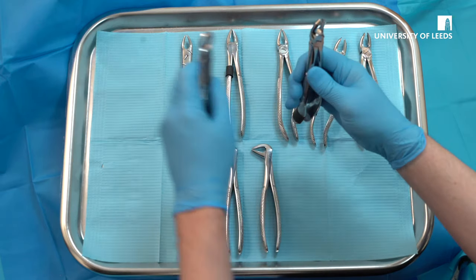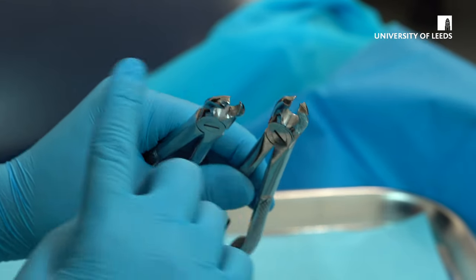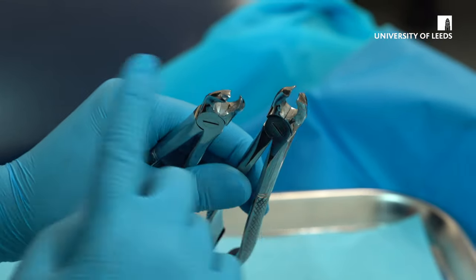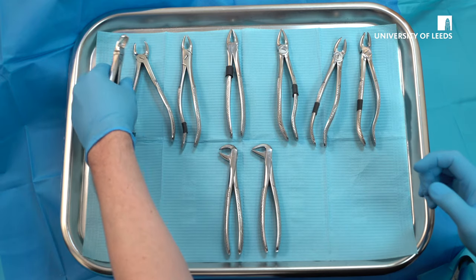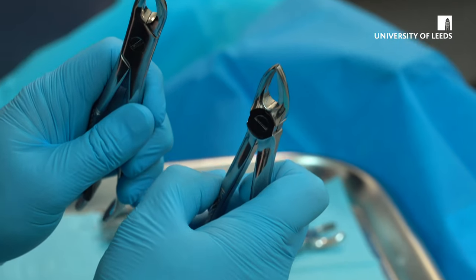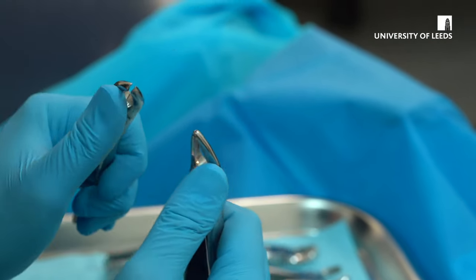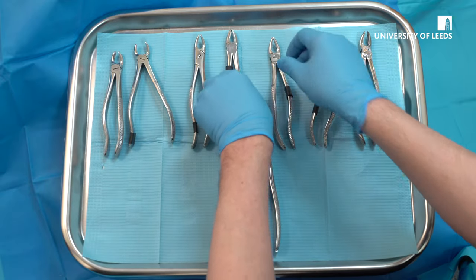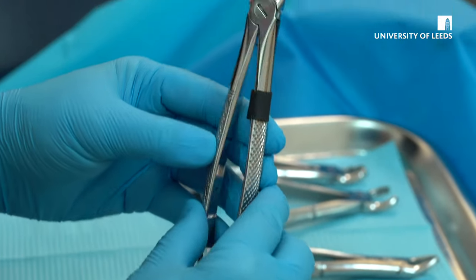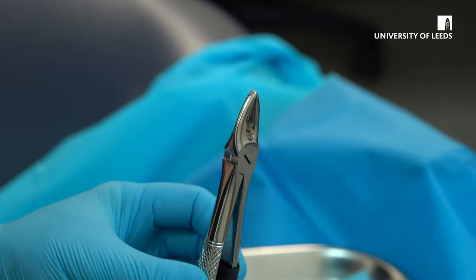It's important to distinguish between your molar forceps with the beak being to the cheek — these are for the upper left and these are for the upper right. The other forceps you see here are for premolar extraction, so upper fours and upper fives; you'll note that they do not have a beak. The universal straight forceps are used for anterior teeth, so upper incisors and canines.